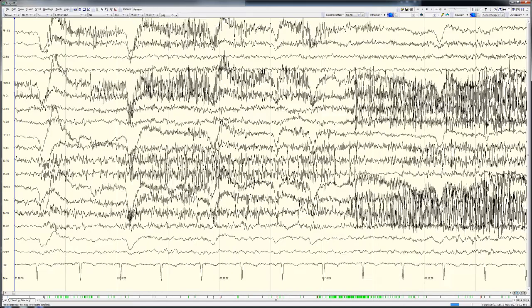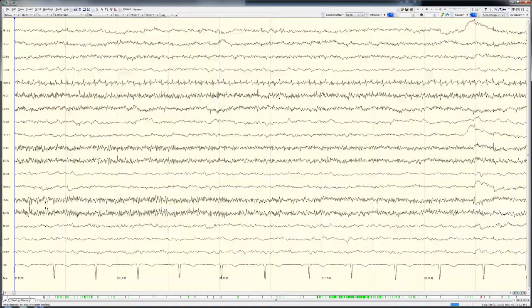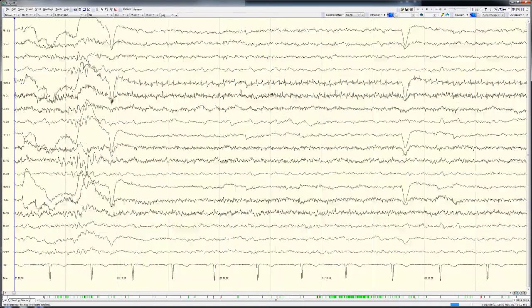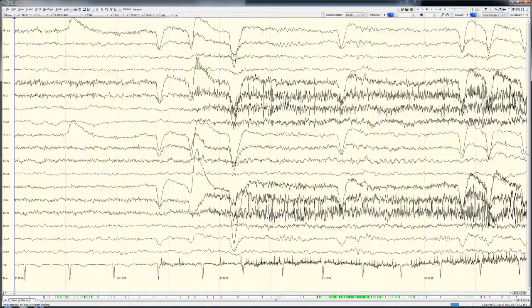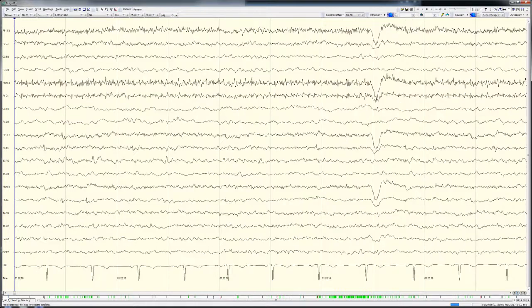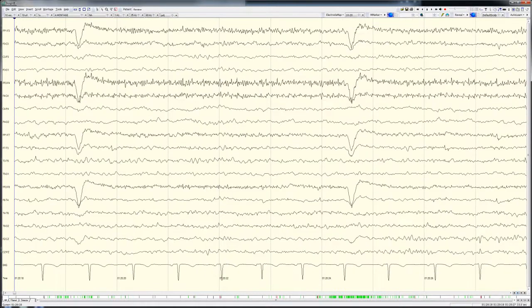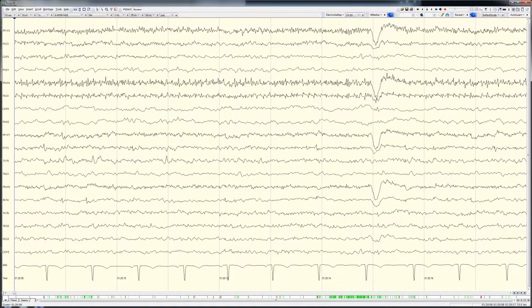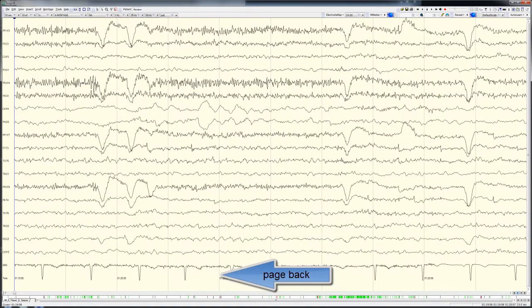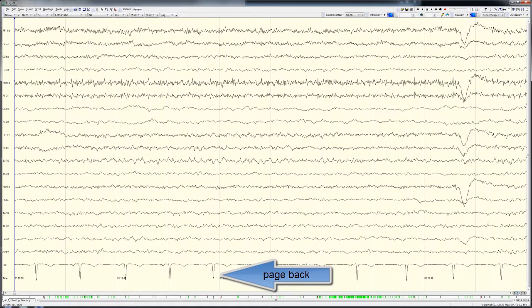At a review speed of 40 times real-time, without pausing for any other review, it would take an expert reviewer about one hour to review the 38 hours of EEG shown in this example.